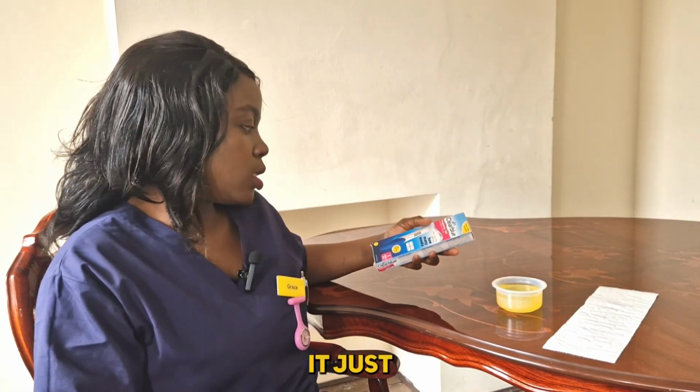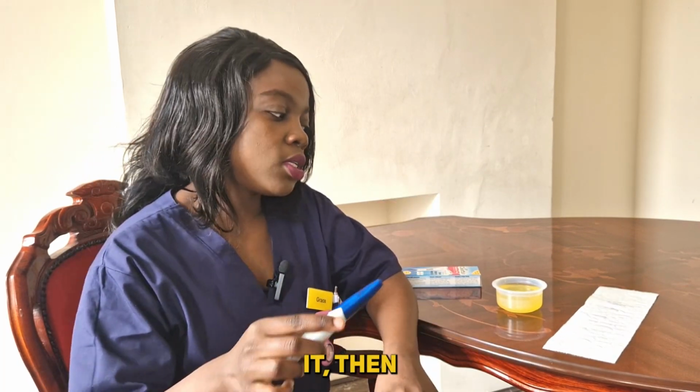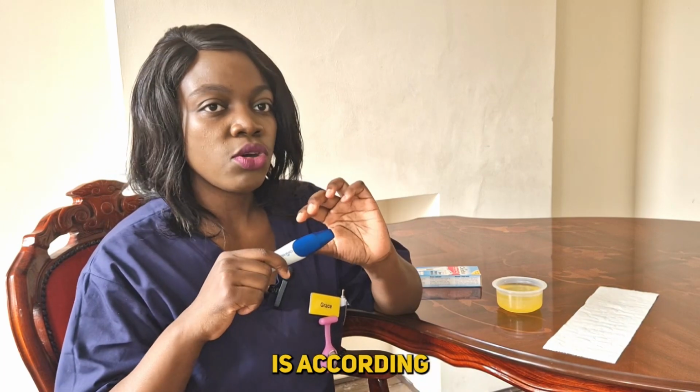So as for this, it just tells me to dip for up to 10 seconds. I remove it, then I drop it on my tissue paper. When I drop it, I'll just leave it for up to about 5 minutes, then I will check my results. So that is according to this strip.